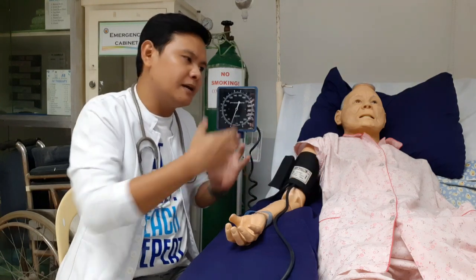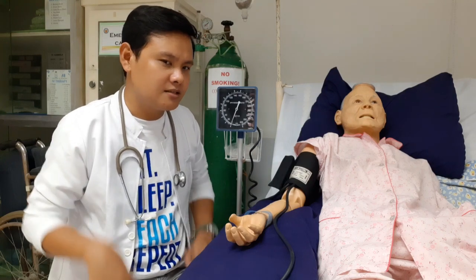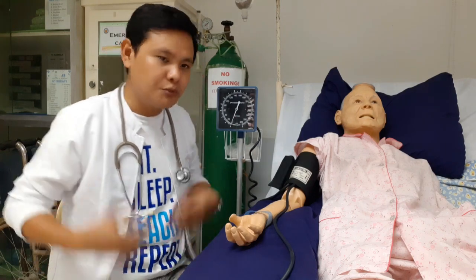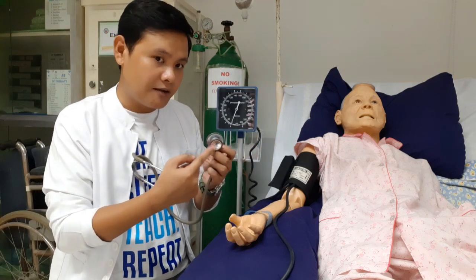So most probably, if we apply another pressure, we will get a high BP. So at least 2 minutes, let's wait. 1 to 2 minutes will be enough. Okay, position the stethoscope. As I've told you, what we will use here is what you call this one?